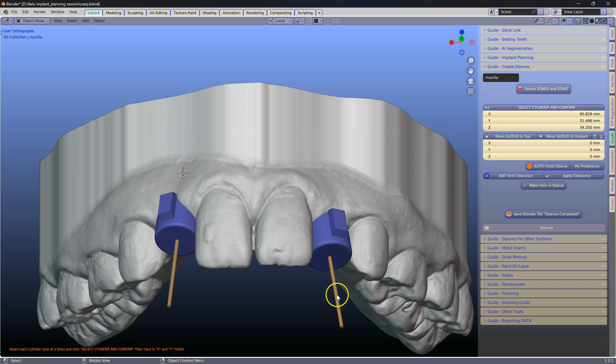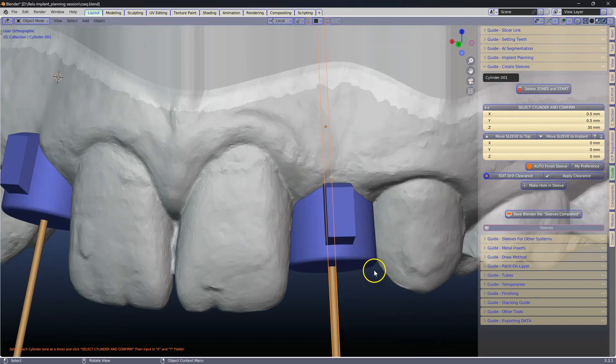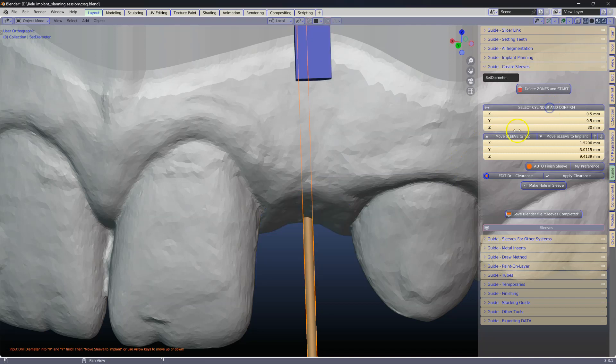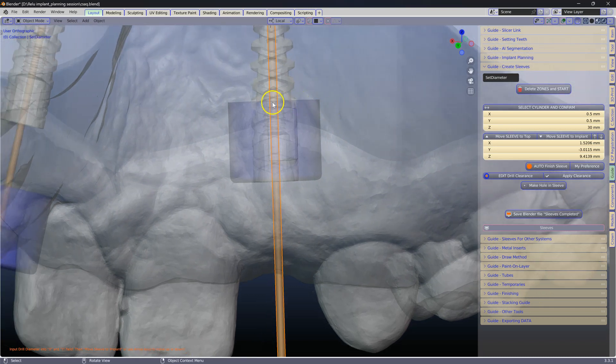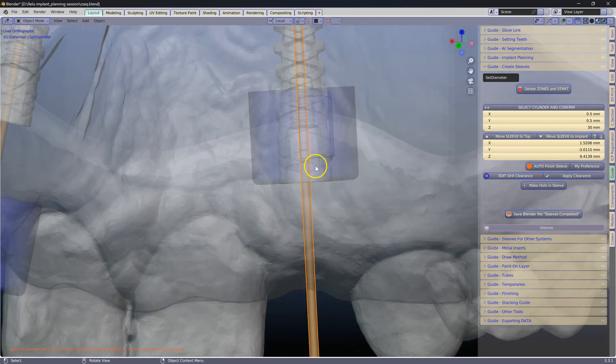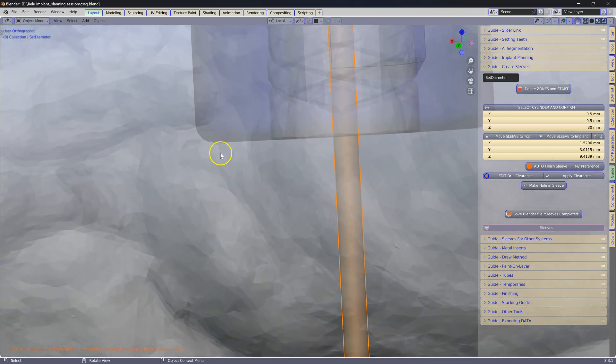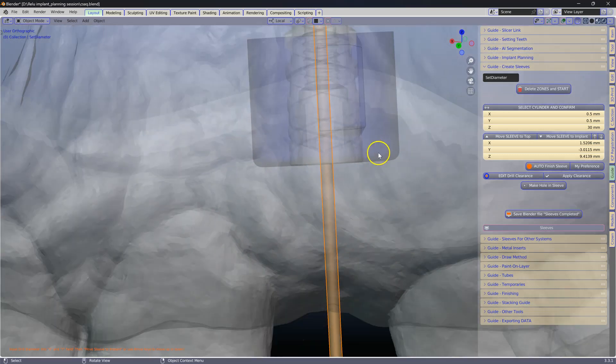Select one of the cylinders and we are going to click on this button. Select on confirm. Notice how the original sleeve has snapped itself to the point zero position, which is the top of the implant head.